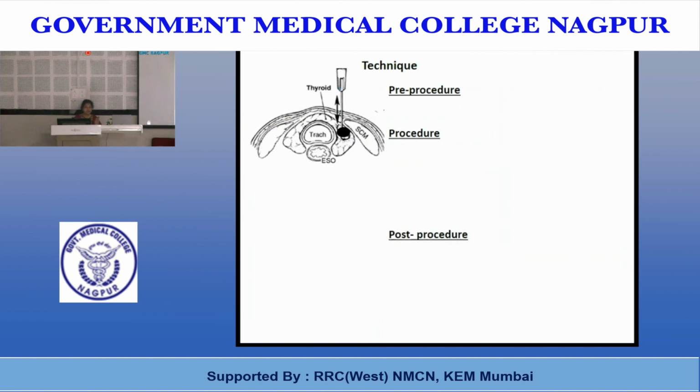Now there are some prerequisites prior to the procedure, during the procedure, and after the procedure. And always remember, before you start the technique, instruct the patient not to swallow or speak. It will increase the bleeding out there.